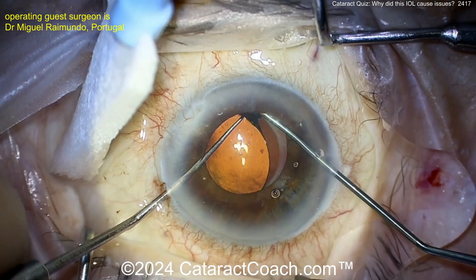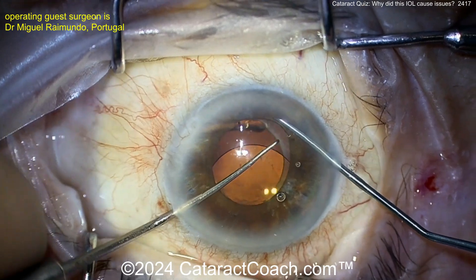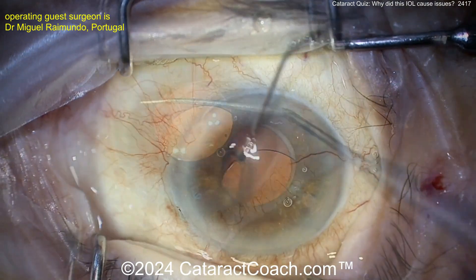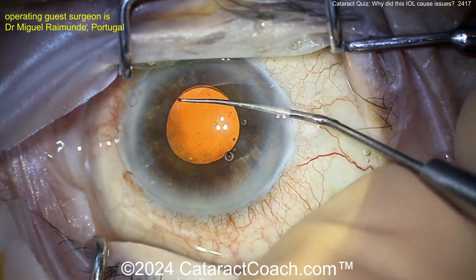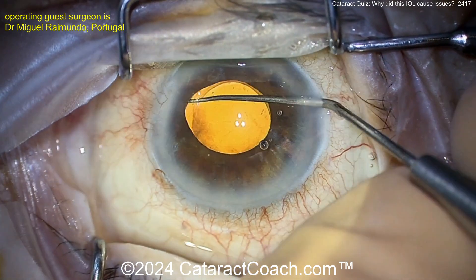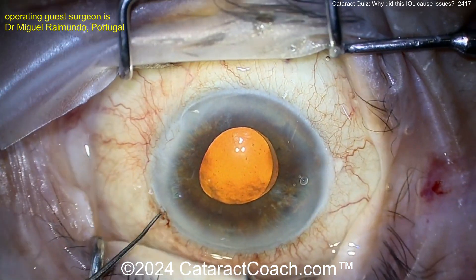You can also have the same problems if you have one haptic in the bag and one in the sulcus. The surgeon is now doing a full dissection. I'm watching the video for the first time with you, so we'll check it out together. Are we just going to leave the lens in the bag? There it is — I like to use the Sinsky hook to kind of dial things around.